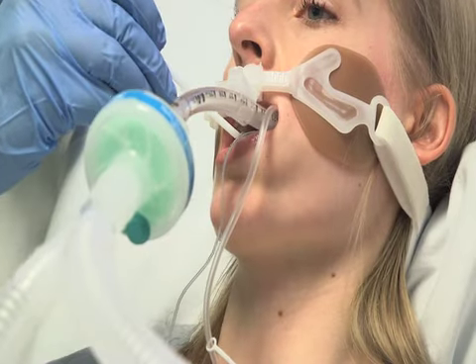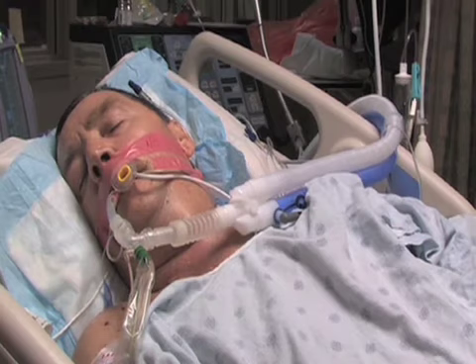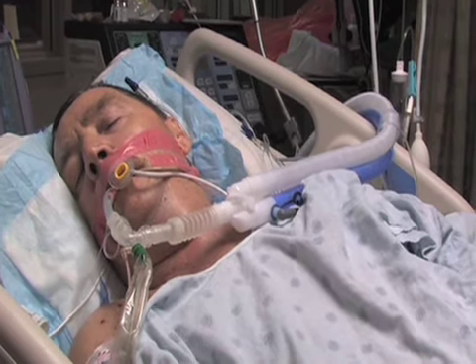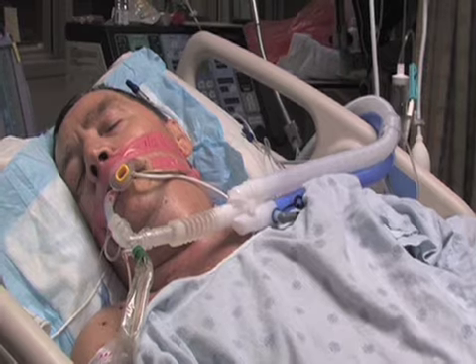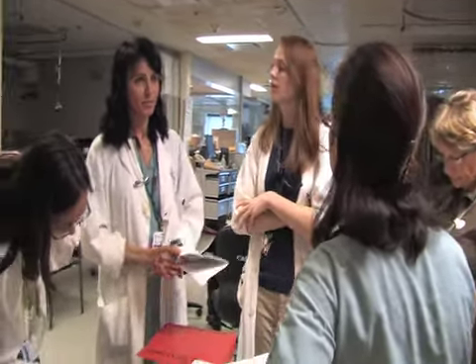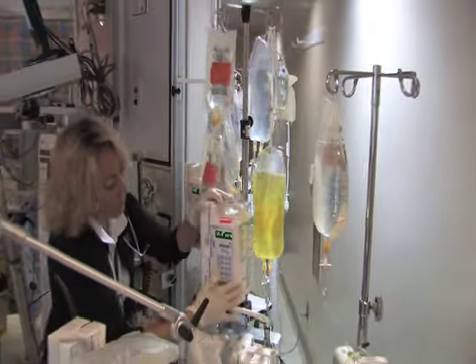Oral care is an essential element of patient care in the intensive care unit. However, oral care delivery in mechanically ventilated adults may not always receive the attention it deserves. This lack of recognition may be attributed to the high-pressure, highly technological critical care environment and competing care demands.